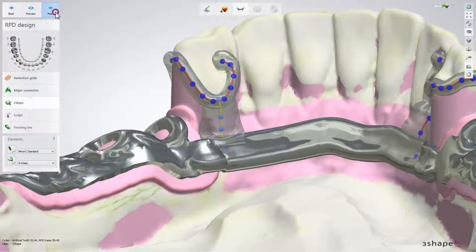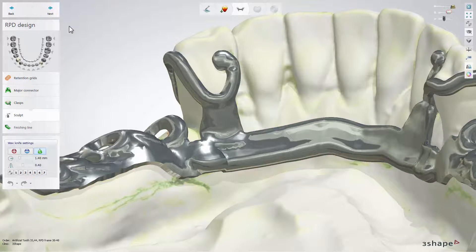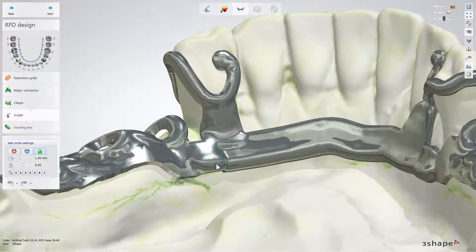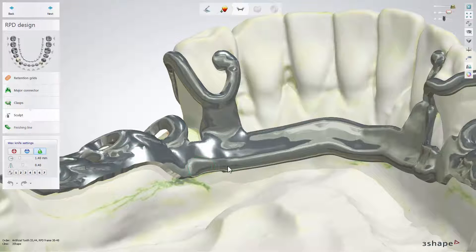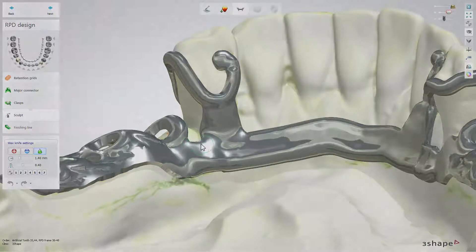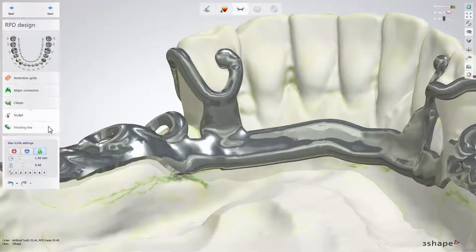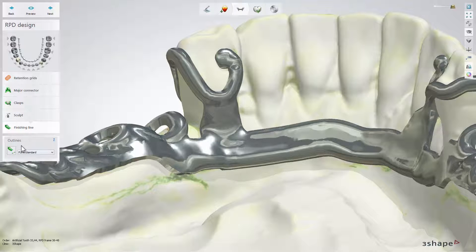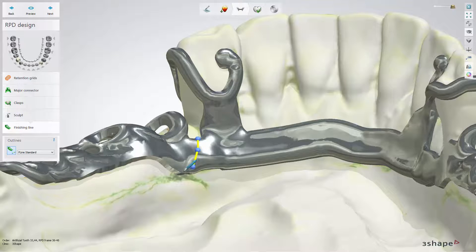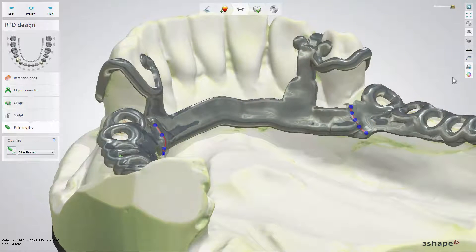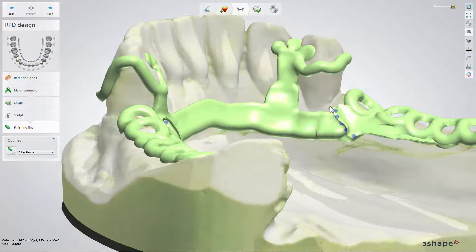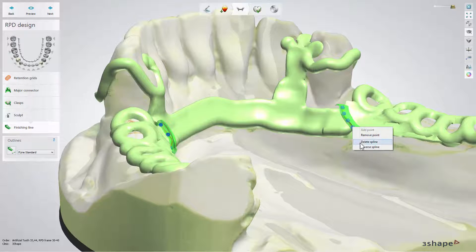Click Next to move to the sculpt sub-step. Now you can smooth the sharp inner corners near the interproximal zone, since placing the finishing line on sharp corners can lead to undesired results. At the finishing line sub-step, place the spline by clicking the corresponding button and draw it on the model. To swap the line direction, right-click on the spline and select Reverse Spline.